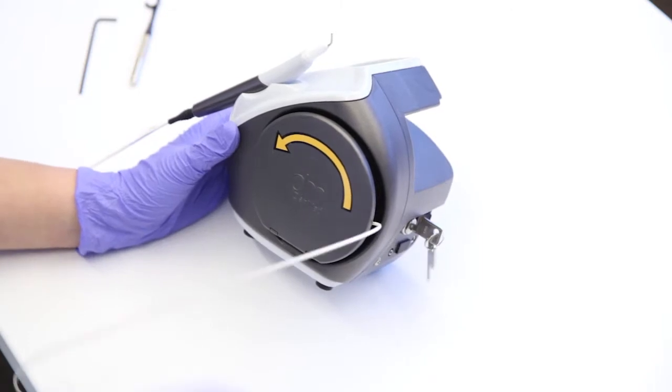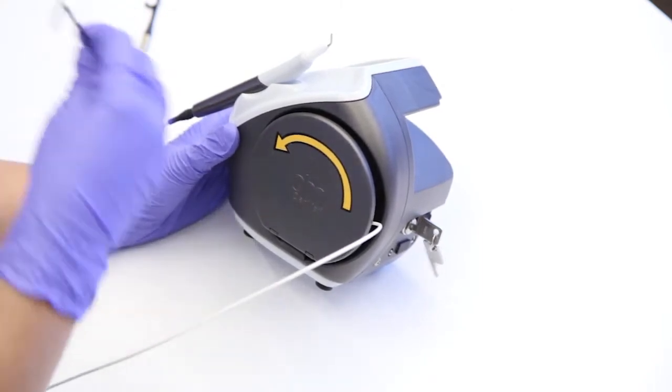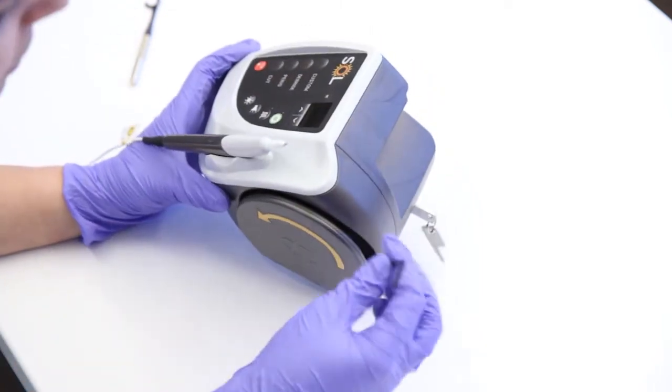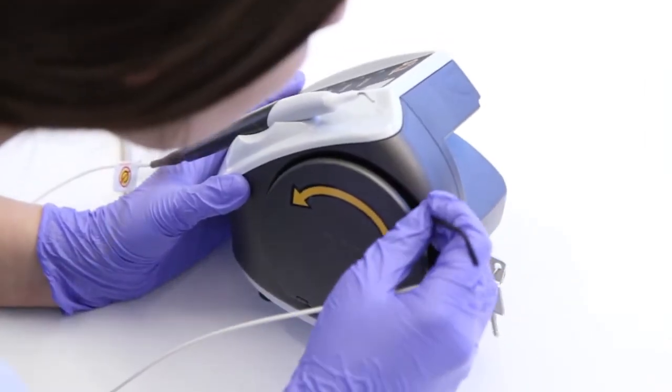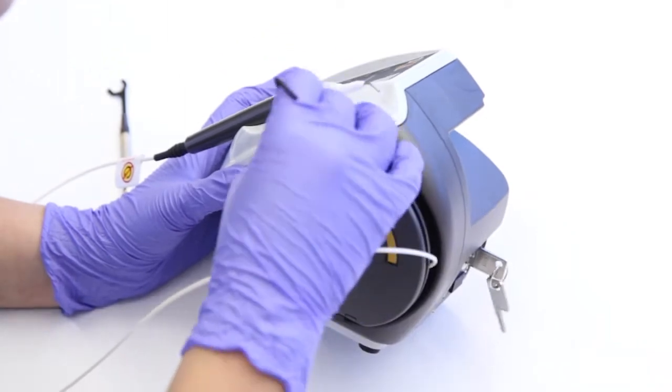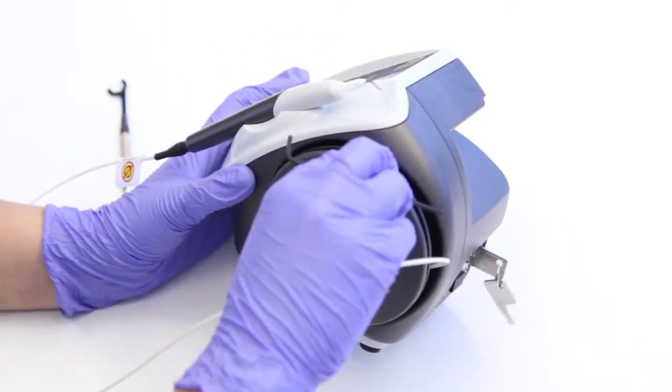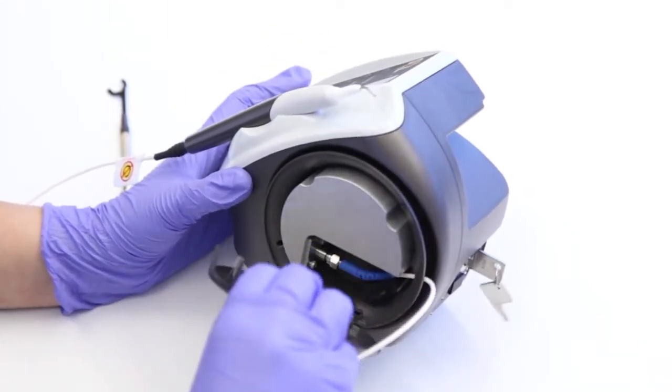First, locate the two locking tabs within the fiber wind cover, located roughly at 10 o'clock and 2 o'clock. Take the hex key and firmly press down on one locking tab at a time. Pop off the wind cover to expose the diode assembly aperture.